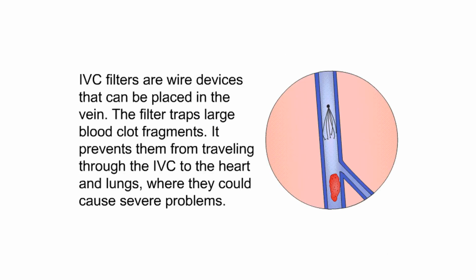Summary. IVC filters are wire devices that can be placed in the vein. The filter traps large blood clot fragments. It prevents them from traveling through the IVC to the heart and lungs where they could cause severe problems.